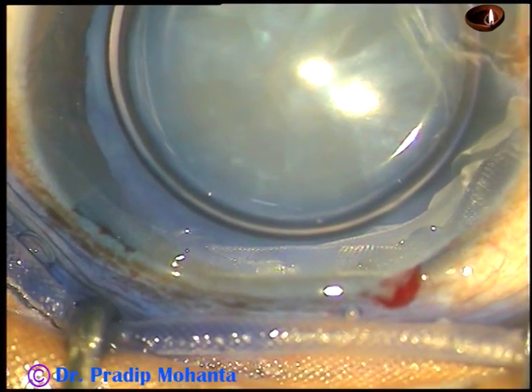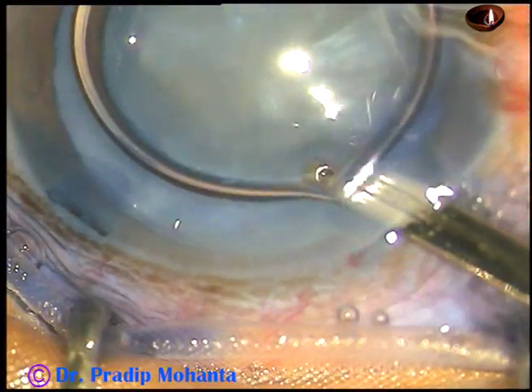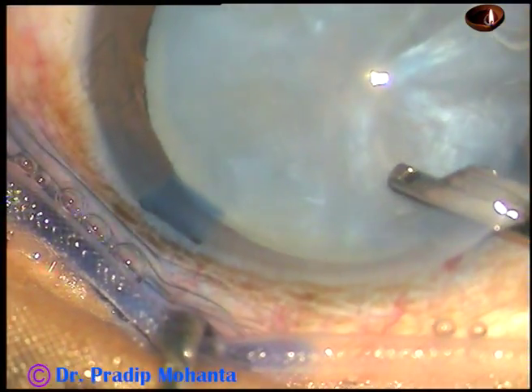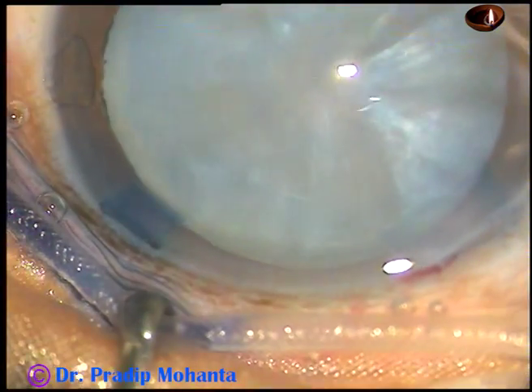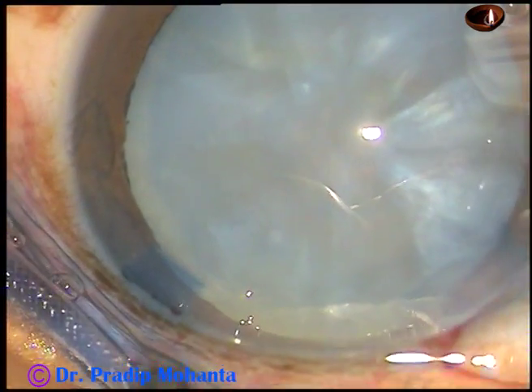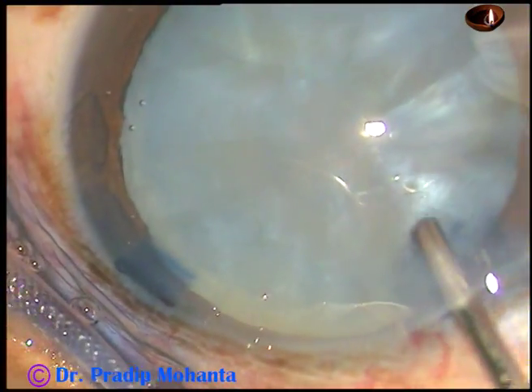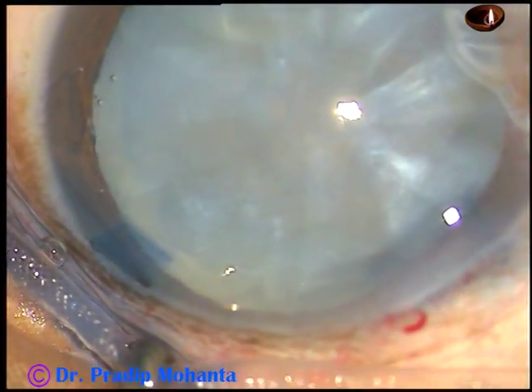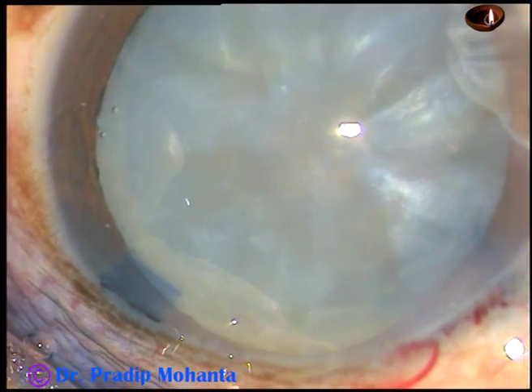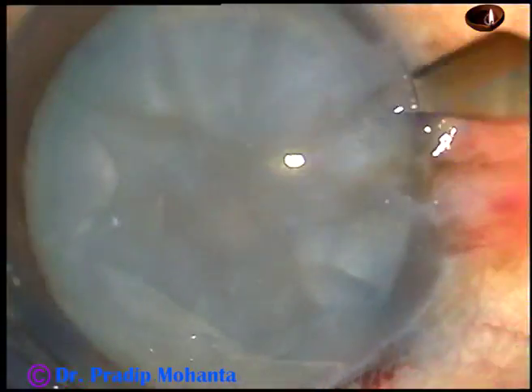And now the dye is washed out with BSS. Then the viscoelastic substance I am using in this case is hydroxypropylmethylcellulose — not sodium hyaluronate. And now one more side port is being made on the right side.